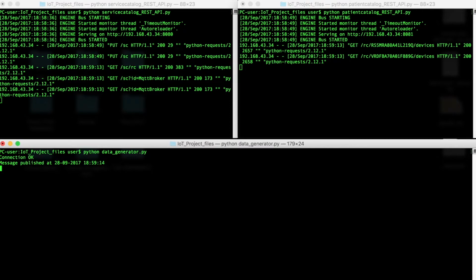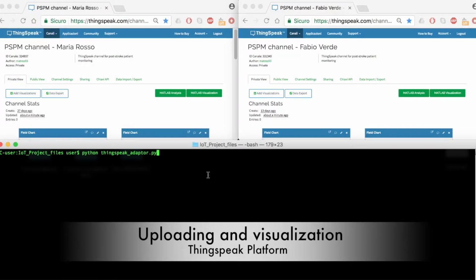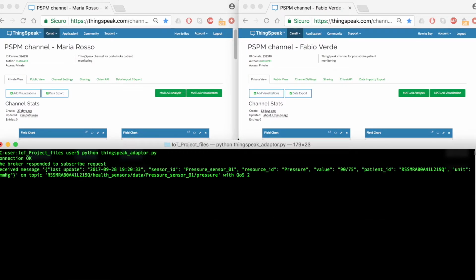Now, we can launch the data generator. It works as an MQTT publisher, generating emulated data for each patient. In this case, it will publish data to the broker every 20 seconds, as we can see from the screen. Then, we can run the ThingSpeak adapter, which receives emulated measurements from the data generator and publishes received data in real time onto the ThingSpeak platform.